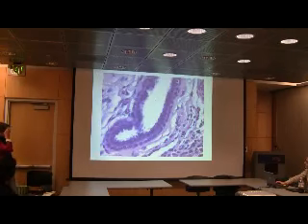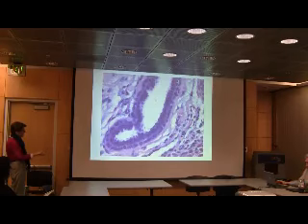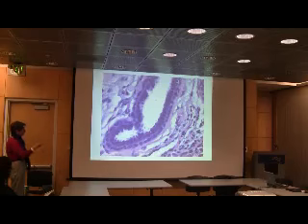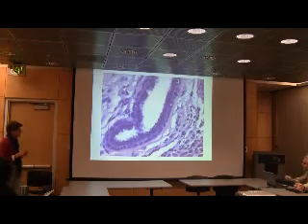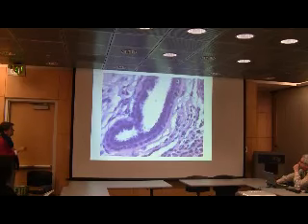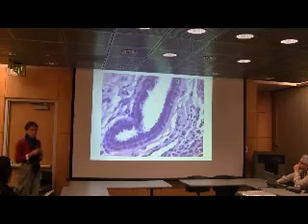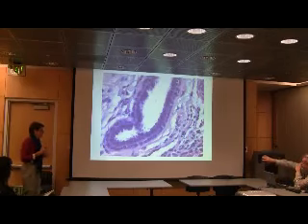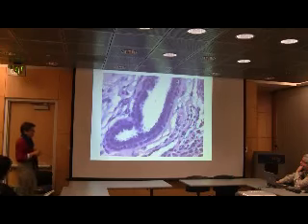All right, so here is the picture where you can really see the two layers really well next to each other. So you have myoepithelial cells lined up really prettily here, and then you have the luminal cells on the inside. This happened to be cut in a very favorable way where you can really see it. It goes actually from a fibroadenoma that has a slightly different type of stroma. You can see a little bit of that. It's a little softer, a little more gelatinous than the typical stroma. And a lot more cellular. Yeah, it can be. There's more cellularity down here. It can vary in cellularity.